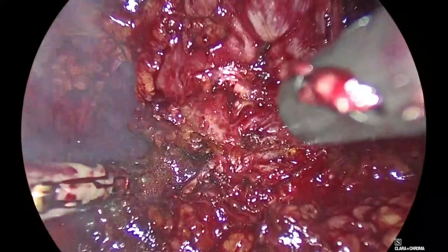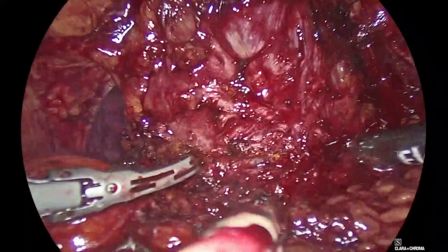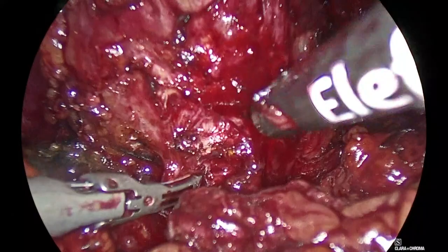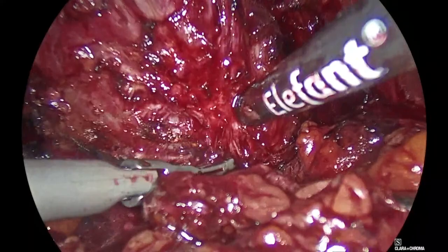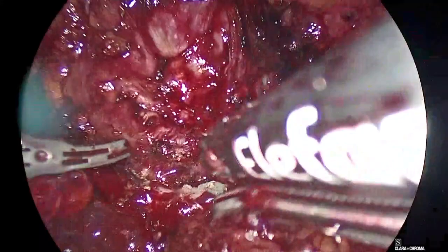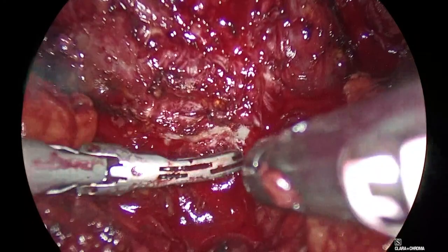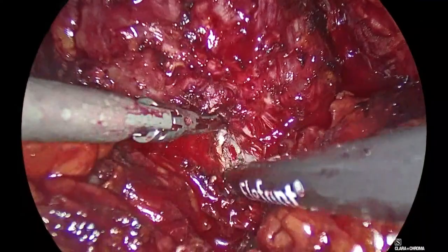Good. Good. Okay, go centrally, Panagiotis. Show me here. Here. Here. Here. Come close. Okay, go back. Go back. Come in. Do you use the same pressures for extraperitoneal surgery as for transperitoneal surgery? Yes.